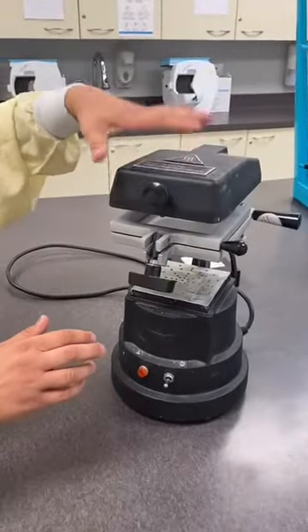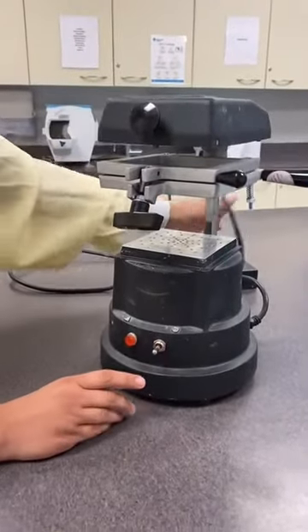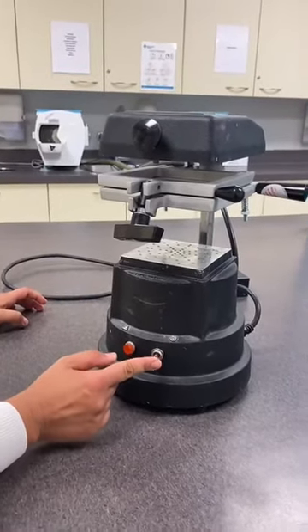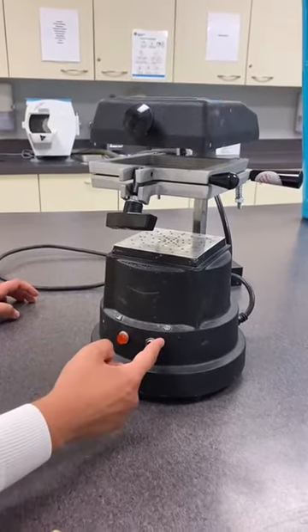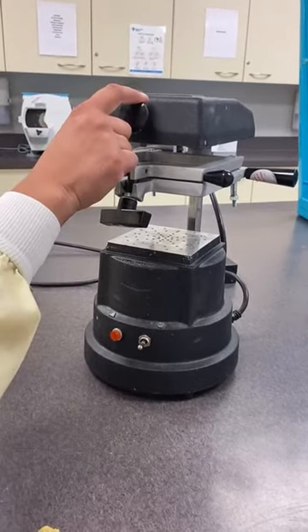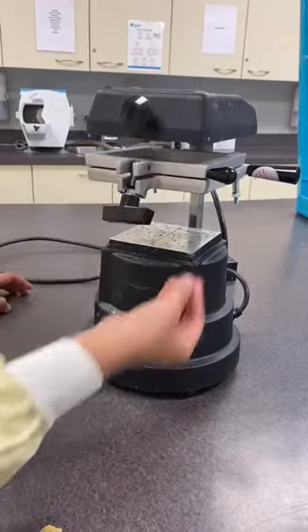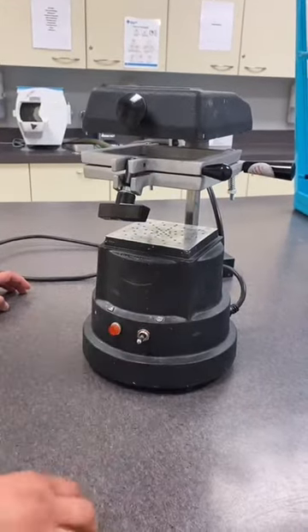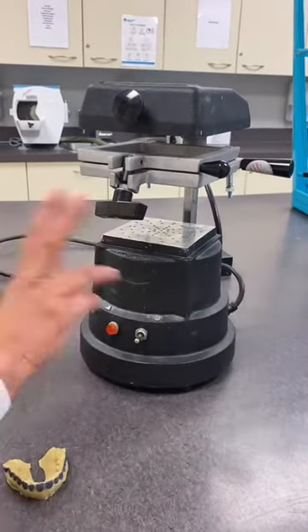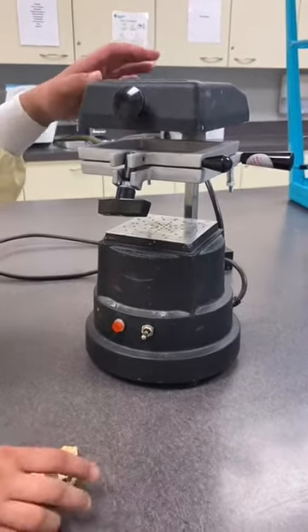Right now it's plugged in. On one side there's a turning knob — it's very simple. Turning the knob one way will turn on the heater, and as soon as you want the suction to activate, once we have the model placed, we turn the knob the other way. Those are the only two options, which makes it really easy.